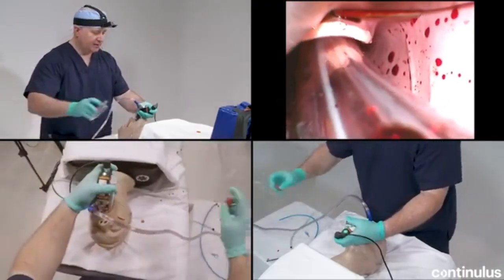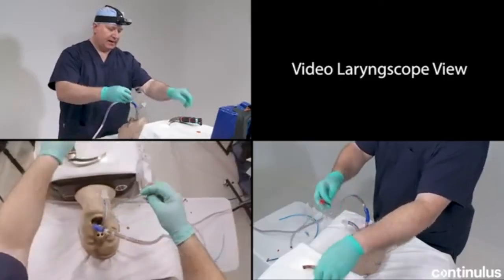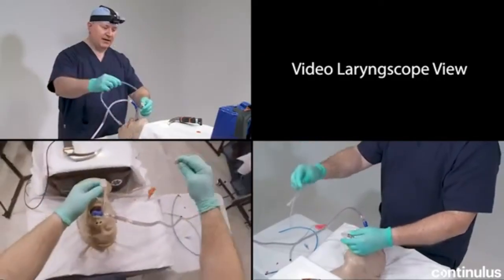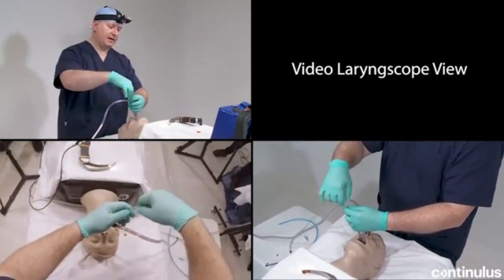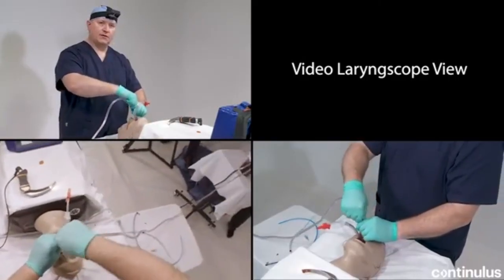So what I'm going to do is I'm going to go ahead and take my video laryngoscope out, and I'm going to run a flexible suction catheter down this tracheal tube. This is a nice, big, juicy 18 French suction catheter. The bigger, the better. Notice that I'm leaving the rigid suction catheter in and transferring it over to the flexible.